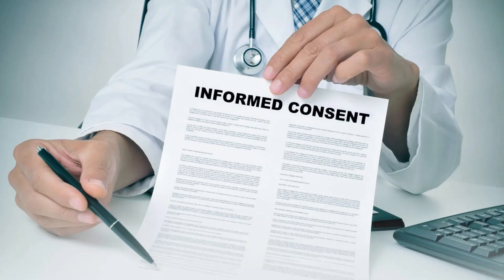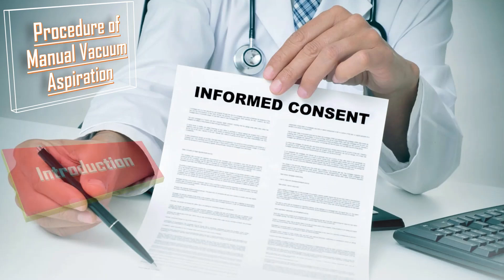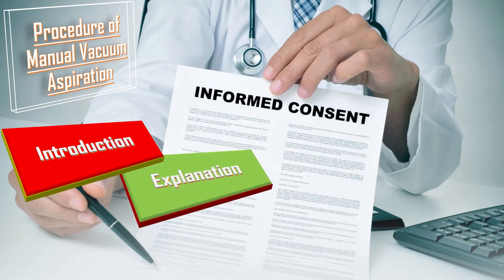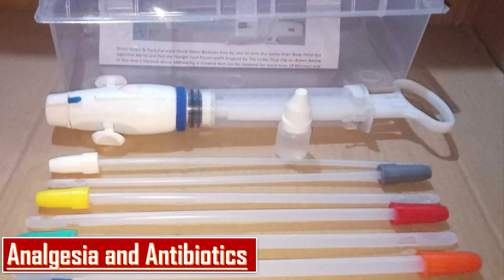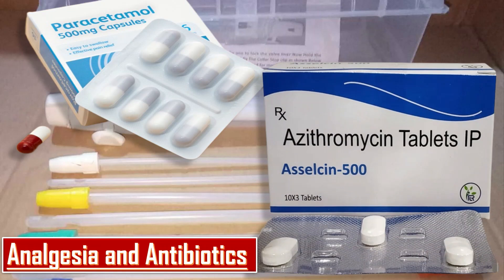Next comes the procedure of manual vacuum aspiration. First, I will introduce myself to the couple, explain the whole procedure along with its pros and cons, take informed consent, and provide emotional support and encouragement to the patient. For analgesia, I will give tablet paracetamol 1 gram or tablet ibuprofen 400mg about 30 minutes before the procedure. For antibiotics, I will give tablet azithromycin 1 gram orally before the procedure.